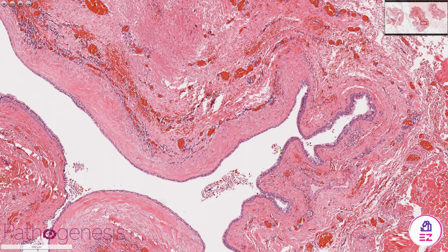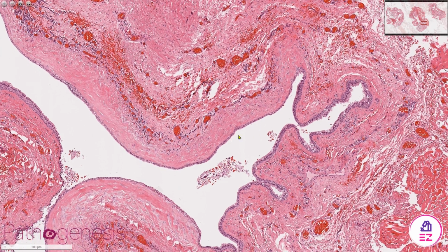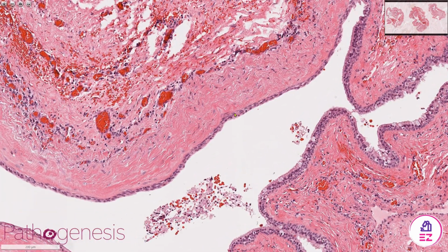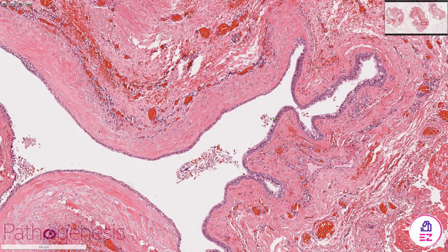excision. So a nasolabial cyst, like many other types of cyst, has three component parts. So it has a lumen, an epithelial lining, and a fibrous connective tissue wall. Now, the lining of a nasolabial cyst isn't particularly specific, but it tends to have respiratory epithelium, sometimes some squamous epithelium, and then maybe some epithelium somewhere in between.